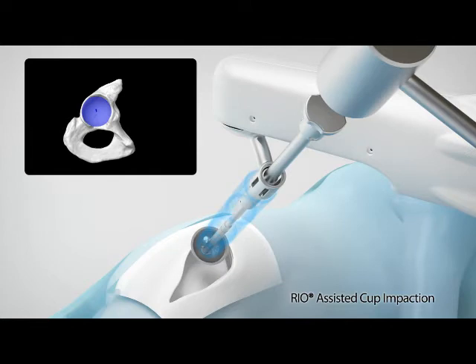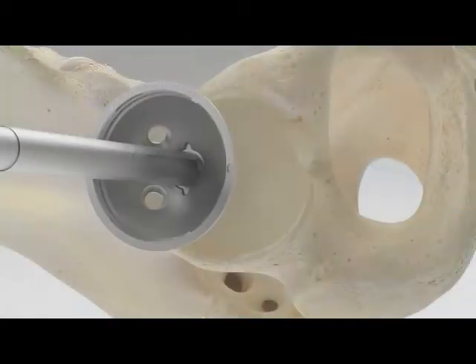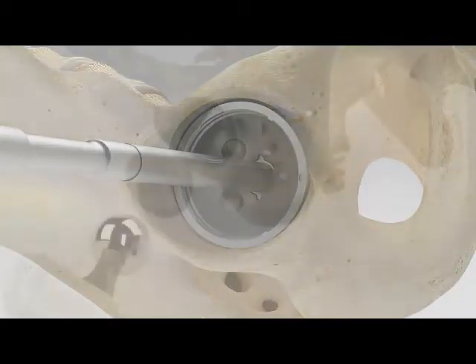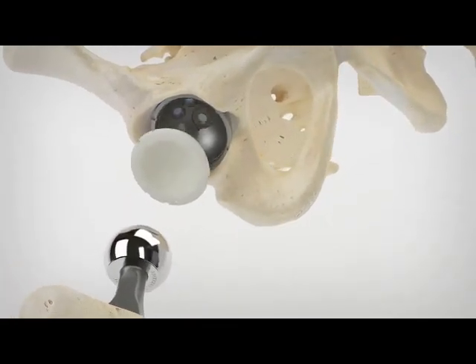The Rio-assisted cup impaction step of the Makoplasty procedure begins by easily switching from the acetabular reaming tool to the cup impactor. As the surgeon prepares to impact the implant into its final position, the Rio holds the acetabular cup at the desired inclination and version defined in the surgical plan.